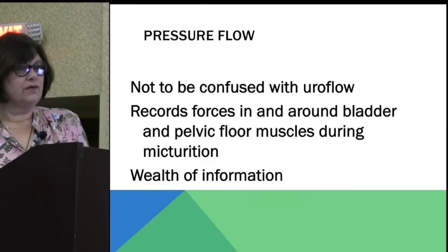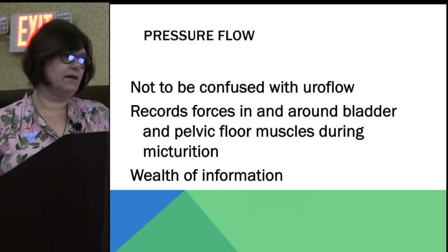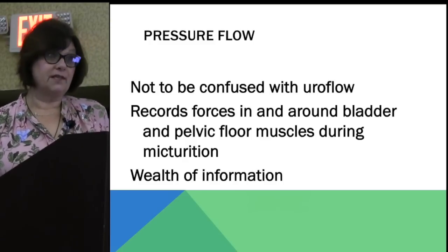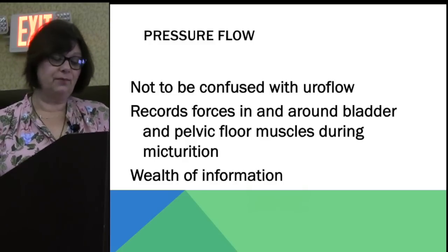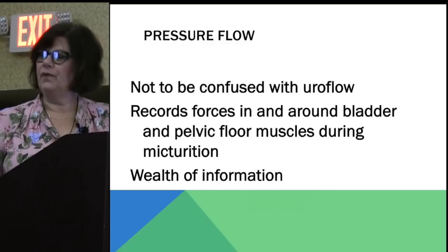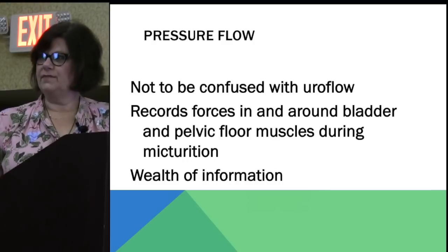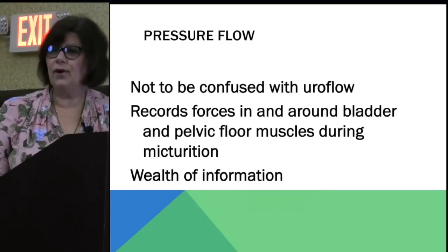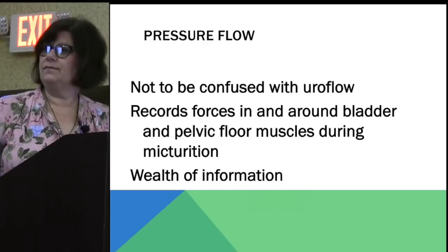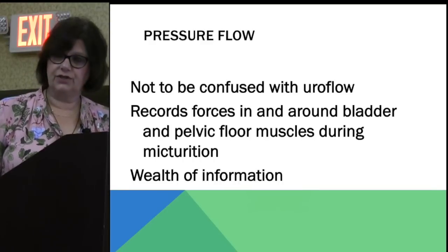Where the pressure flow is when the catheters are already inserted. It's at the end of the test, of the filling of the bladder. And again, it's a pressure flow because we are able to read pressures because the catheters are inserted. And we're able to see how much pressure the patient exerts to empty the bladder. Very important, again, we just saw that EMG earlier, the slide before, that showed the dyssynergia.